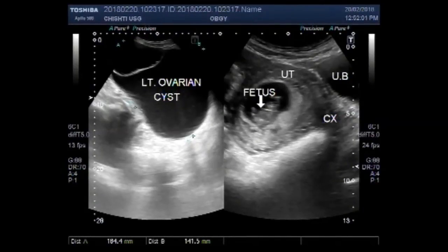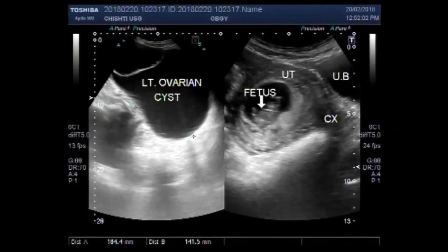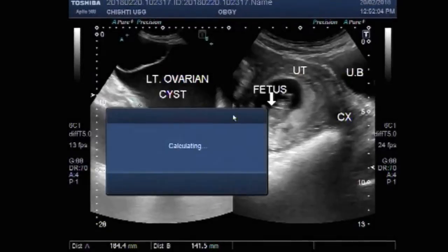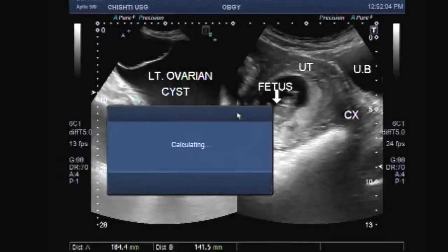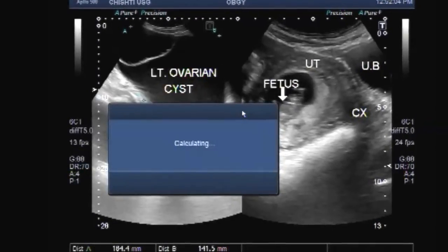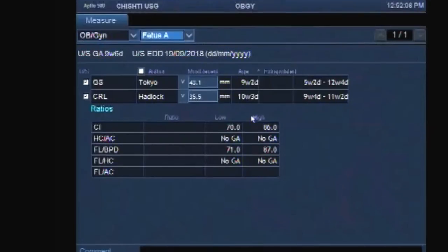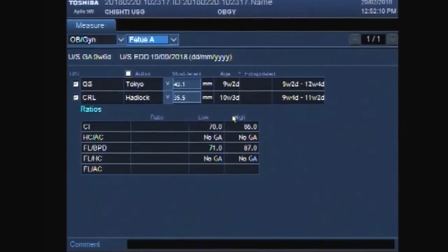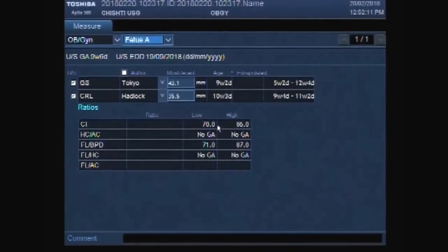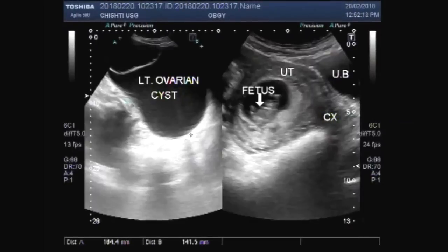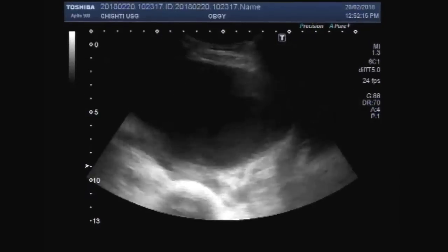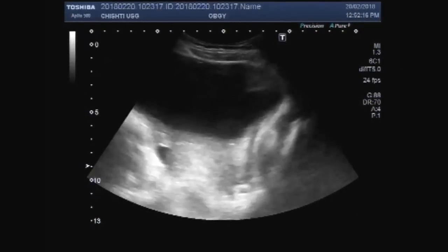Dear viewers, I hope you are all fine. This ultrasound video shows an early pregnancy — a pregnancy of about 10 weeks with a large ovarian cyst.